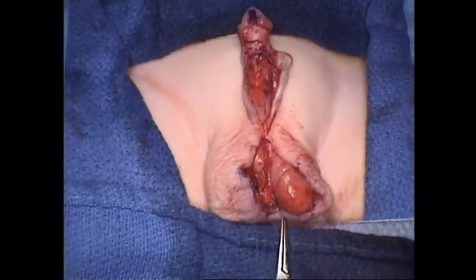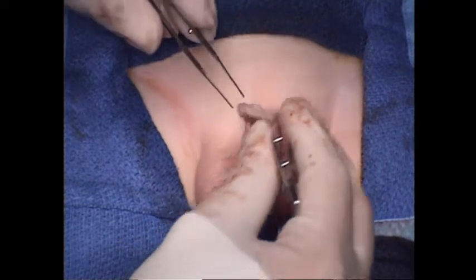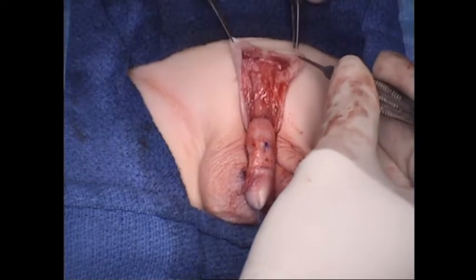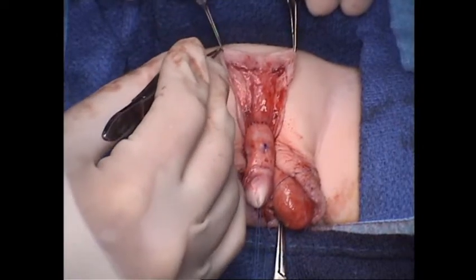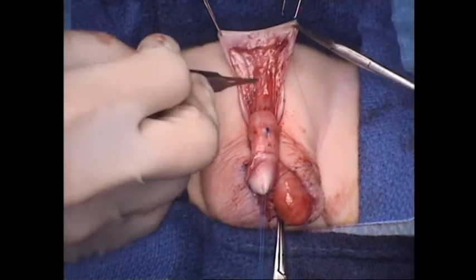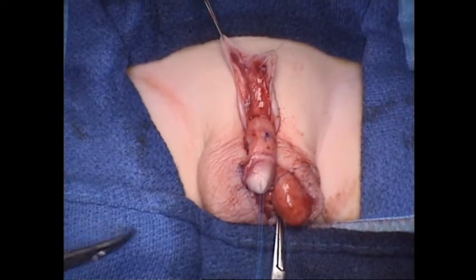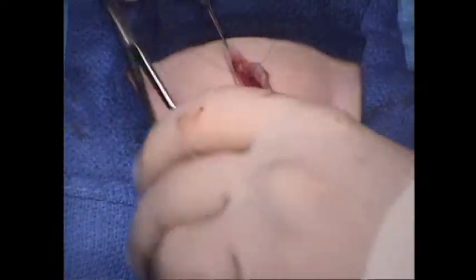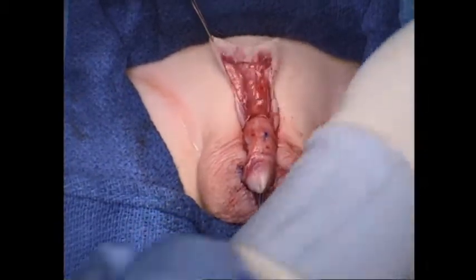Okay. So first we're going to need a 6-0 PDS. And we're going to place those in our corners of the prepucial skin. And this is to help us remove this dartos so that we can unfurl this inner prepucial skin from the outer prepucial and shaft skin below it. That's another key point. Some of you watching have been accustomed to managing prepuce for flaps, preserving the dartos underneath it.